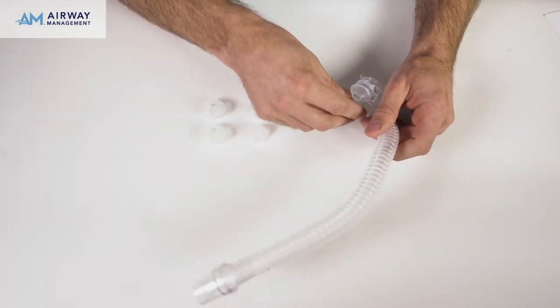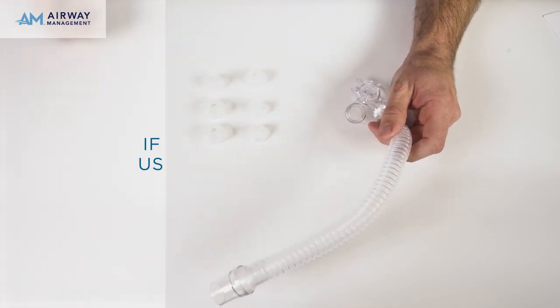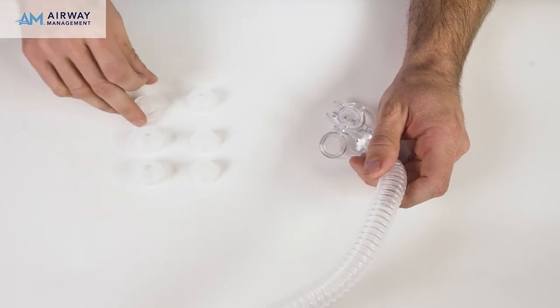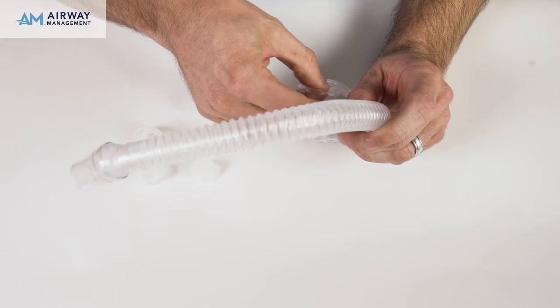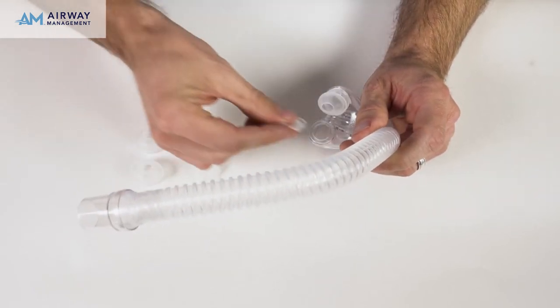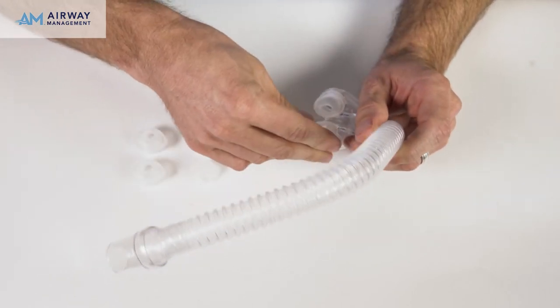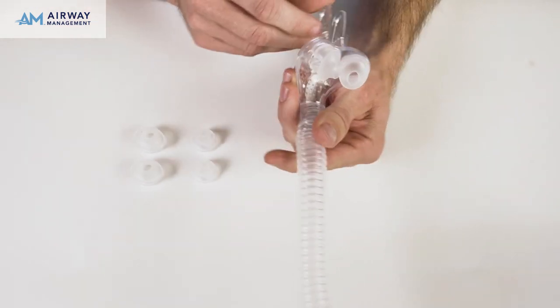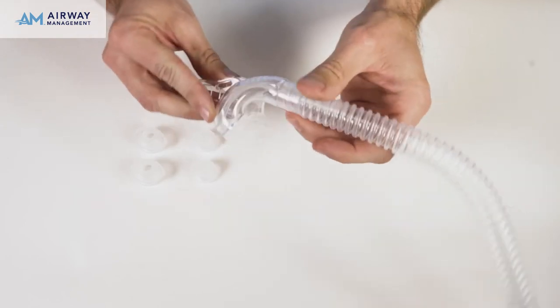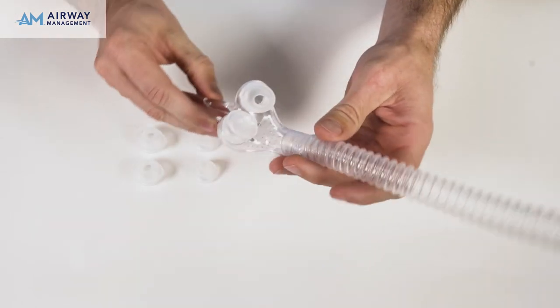To change the size, remove nasal pillows by pulling the seals out of the mask frame. If in doubt about sizing, use large nasal pillows. To reinsert the appropriate size, pick up each pillow individually and squeeze at the base using your thumb and middle finger. Place one side of each pillow into the groove and then use your index finger to guide the other side into the groove. Push firmly down on the seal and turn the mask over and view from the bottom side to make sure the seal is inserted evenly around the ridge.